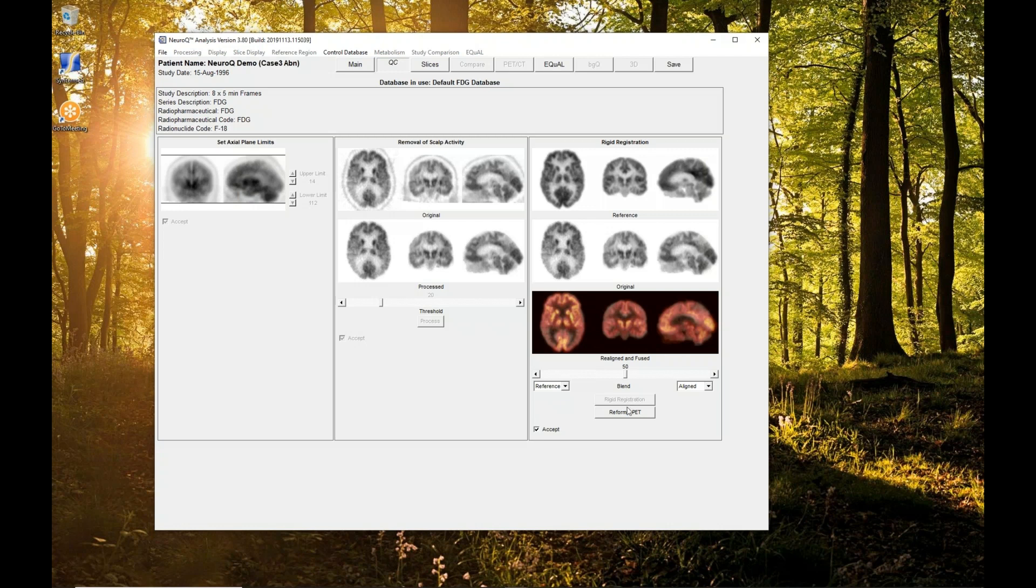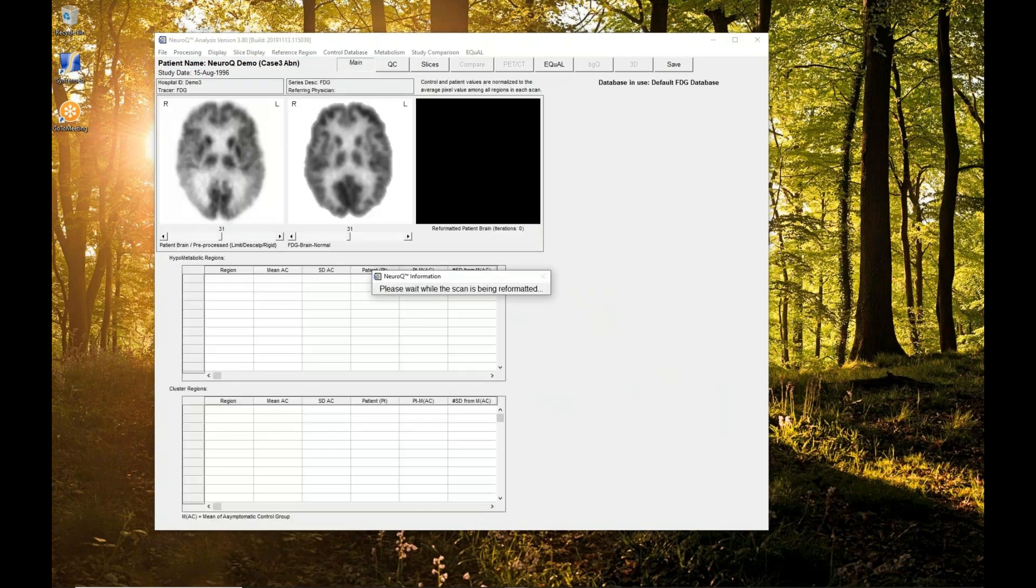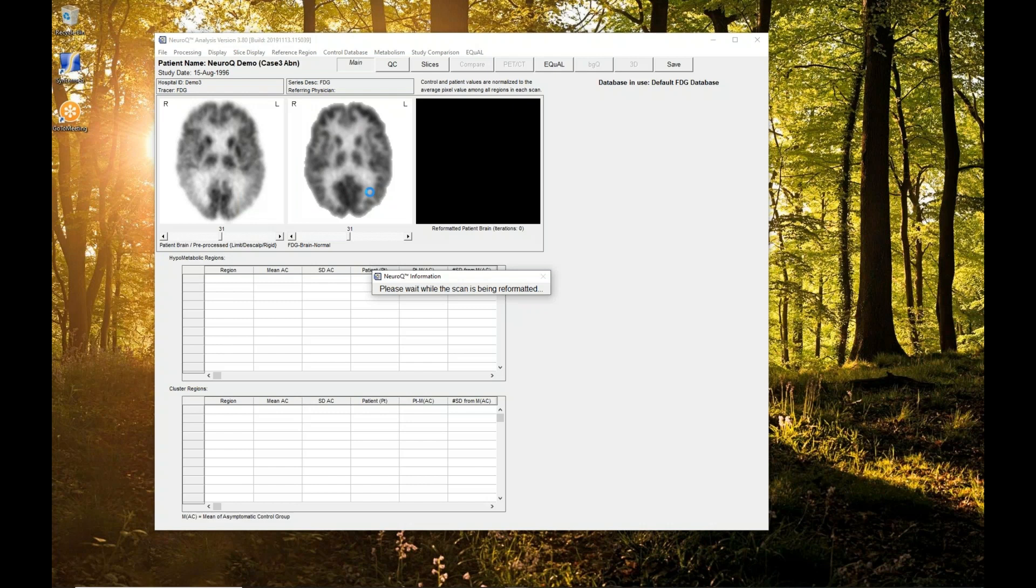Once you do the rigid registration, then you reformat. Now this is a nonlinear reformatting to force the patient brain into the same template space as our template. Once it does that, then the regions and the clusters that are defined on our template can automatically be applied on top of the patient brain, and then we can do the quantification. This doesn't take too long, maybe 20, 30 seconds or so.